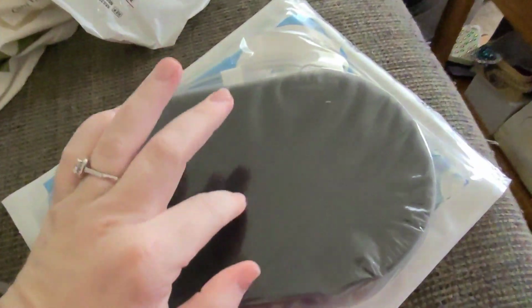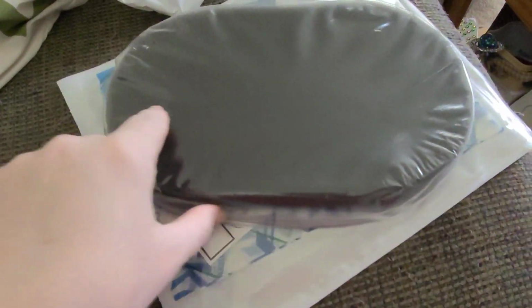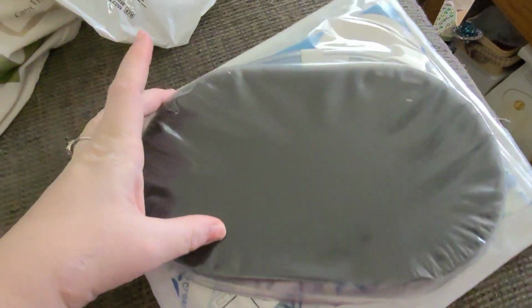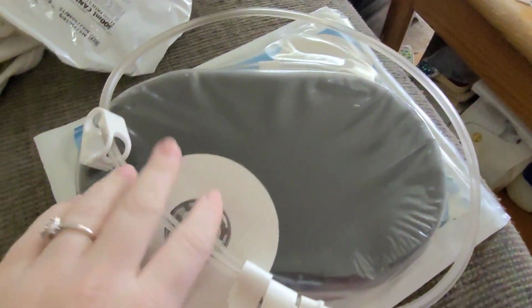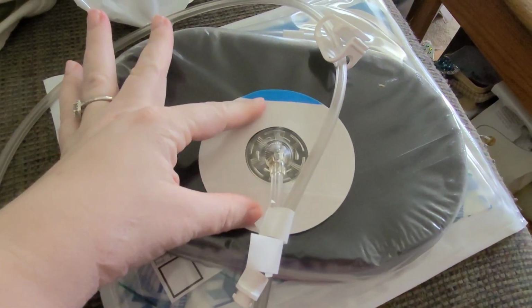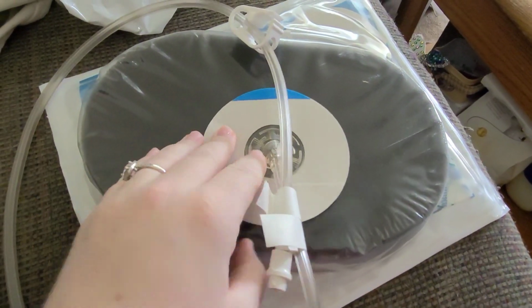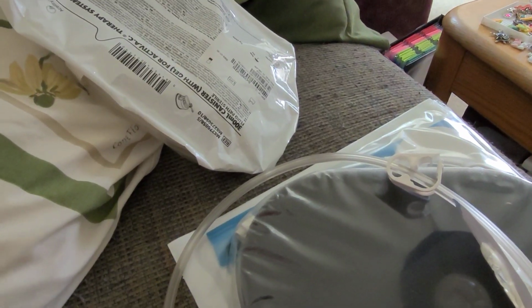This is the foam piece, and I'm not going to take it out yet, because if I take it out, it becomes contaminated and we can't use it. This foam piece, she will cut up and make into the same shape as my wound. Then she'll lay this on top of the wound. Inside here there's also this. You'll see her put this over the top of the wound, and this is what actually sucks everything out. Then this is attached to the machine, which I am going to show you right now.